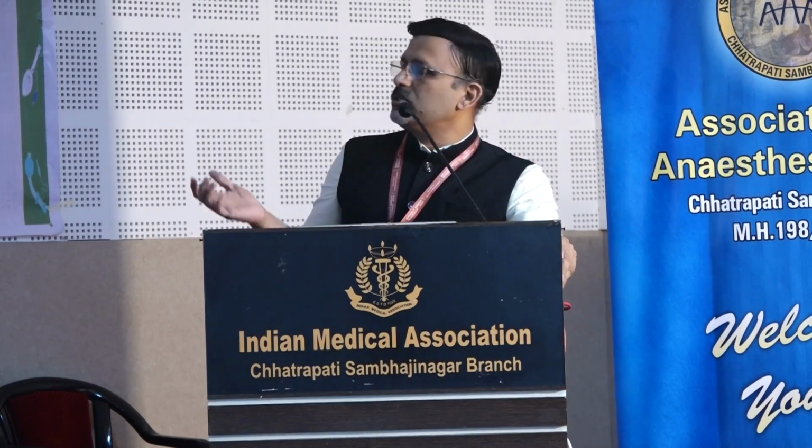There are multiple ways, multiple manipulations, multiple steps by which we can remain at the periphery of this vortex. Suppose you are using a face mask: use it with 2 hands, remove the denture of the patient, use different kinds of face masks, use oral airways. All these measures you can do, but try to ventilate the patient. That is very, very important. Cornucopia of airway tools means an abundance of tools is available to manage this situation. But your primary goal is to maintain an oxygenated patient. You have to remain at the periphery, and that is very, very important.